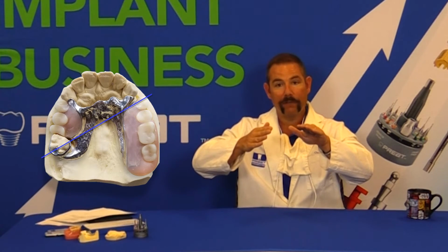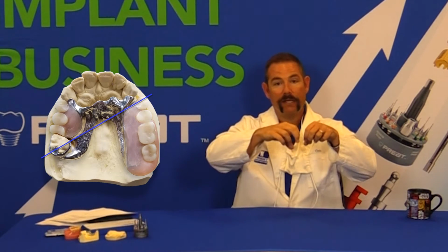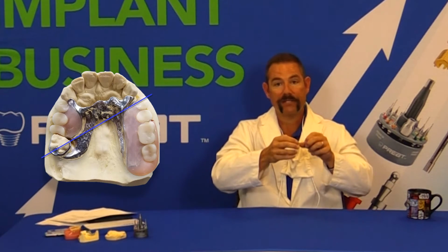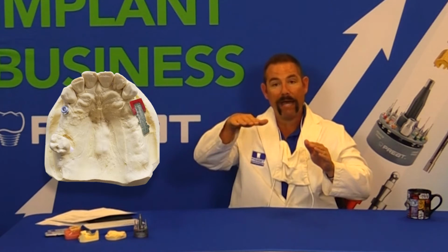What's going to happen when that tooth supported side doesn't allow us to pivot and move? This free end side wants to flex, and we're going to have a fracture of acrylic and teeth over that fulcrum point. Simple solution to this when we're doing a new case design. Very simple. This is where the old school hinge comes into play. Put that hinge on the free end side. It allows the tissue supported side to function independently. It's not bound by the tooth supported side.